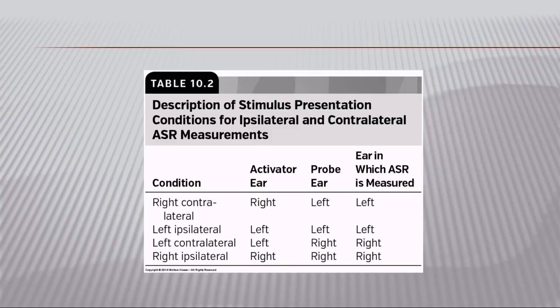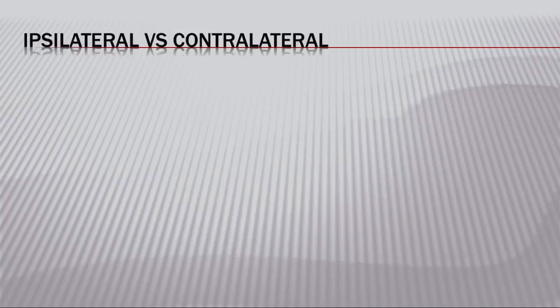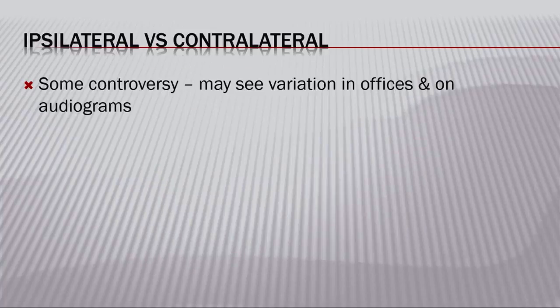And then left ipsilateral and right ipsilateral are easy to remember. And when you go to different offices and different clinical placements, you're going to see this written out many different ways on different audiograms.